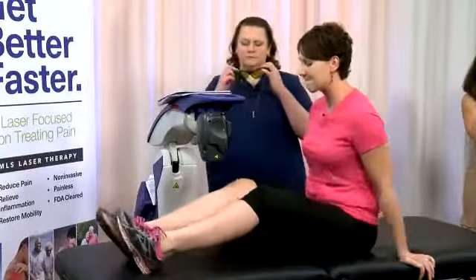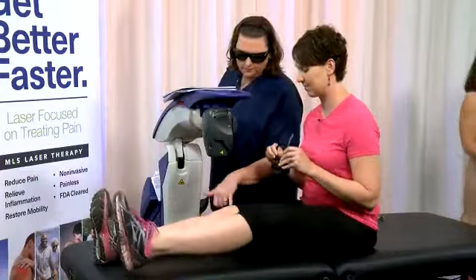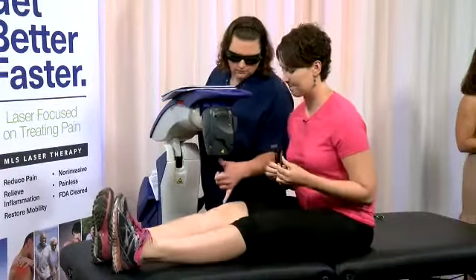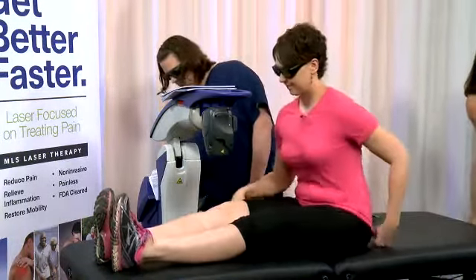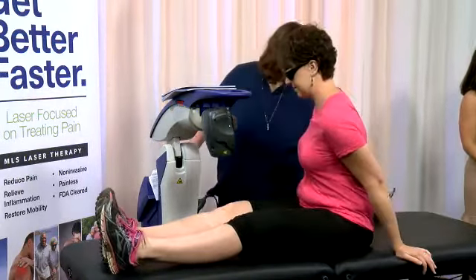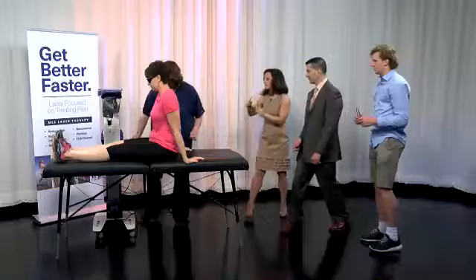Think of this analogy. We've had a terrible winter — it snowed even last weekend. Then the other day it was sunny and beautiful. How did you feel when you went outside? Fantastic. That's exactly how your cells feel when they experience this light energy. It's basically photons of light. We do have to wear goggles for this. As long as you're five feet away, you're okay, but we'll put the goggles on.